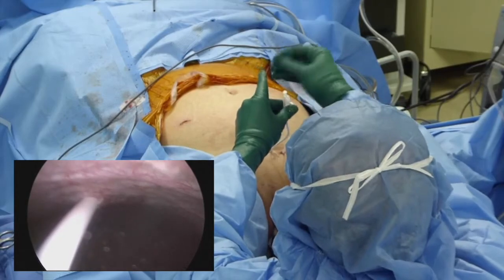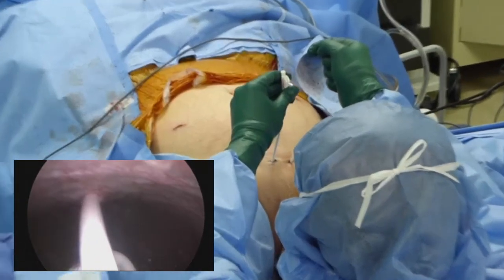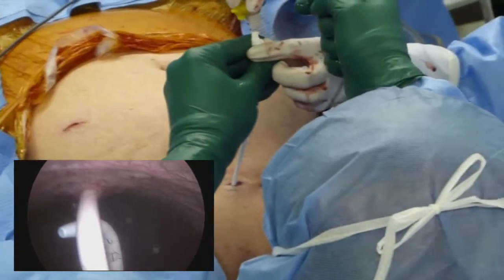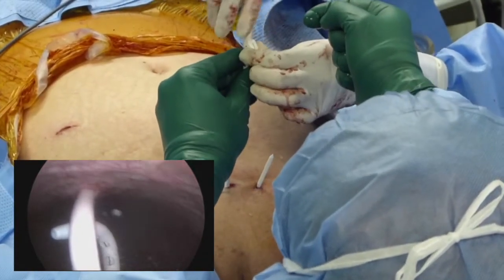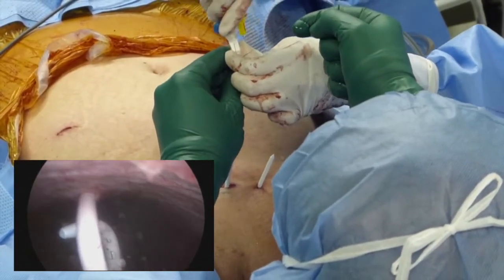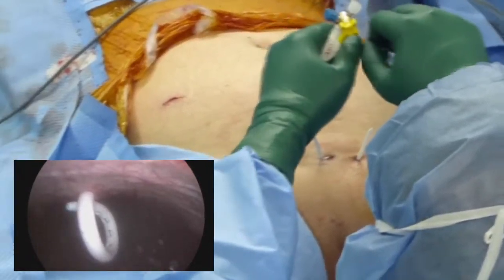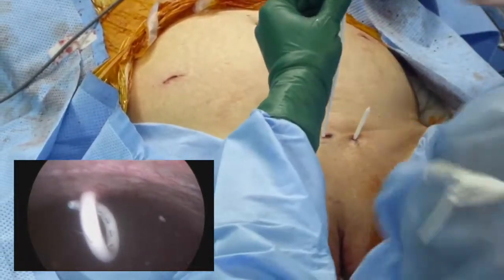Pull on the black string to curl the catheter tip to overlap itself. Press the lever down over the string to lock it in place. This ends the MAC-Lock suprapubic catheter insertion.